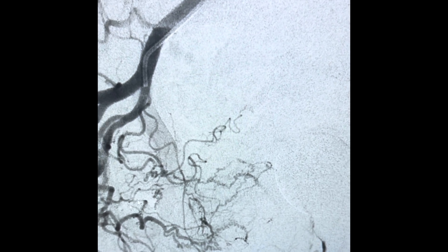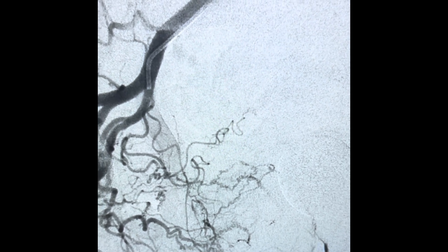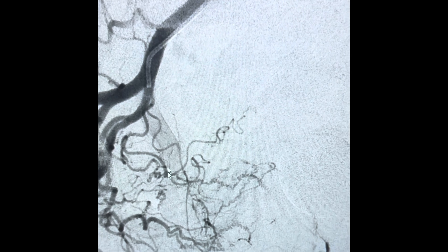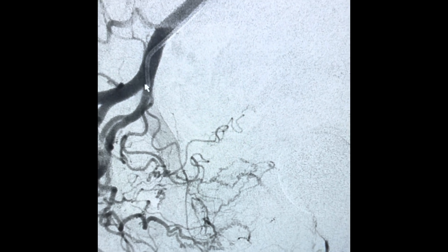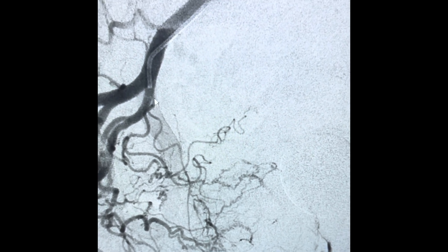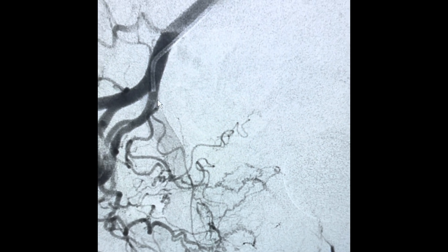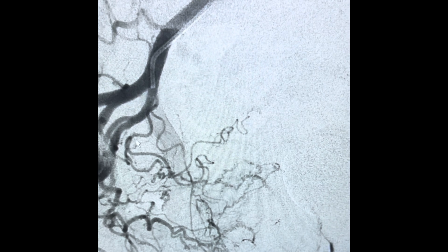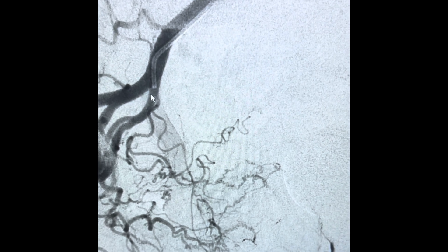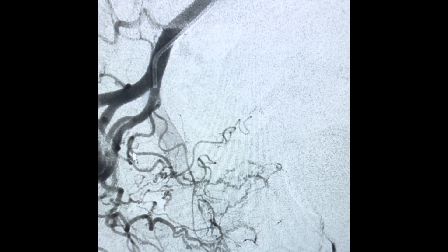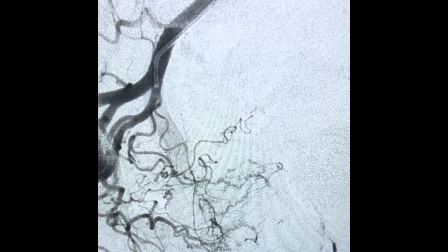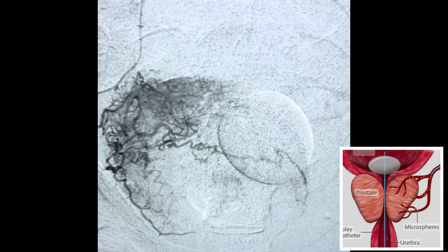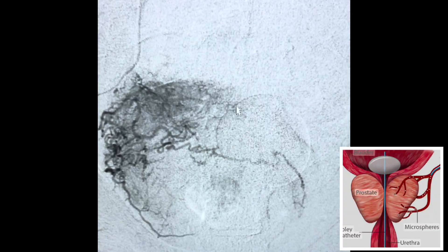This is a really large prostate, which means the prostatic artery is quite large in this patient. This is a common ostium of the superior vesicle and the inferior vesicle artery, and the prostatic artery comes from the inferior vesicle artery and supplies this really large prostate. There's an AP projection of the same thing.